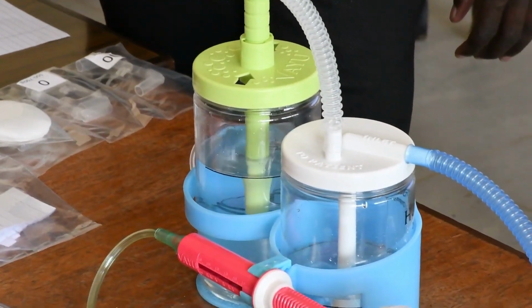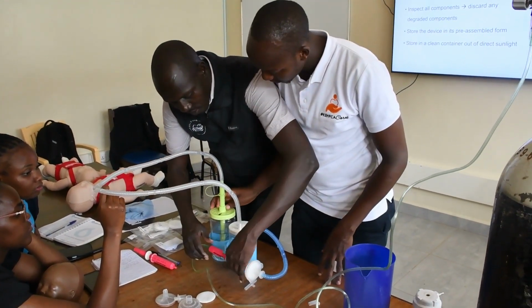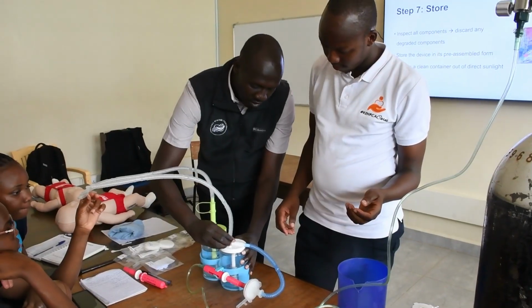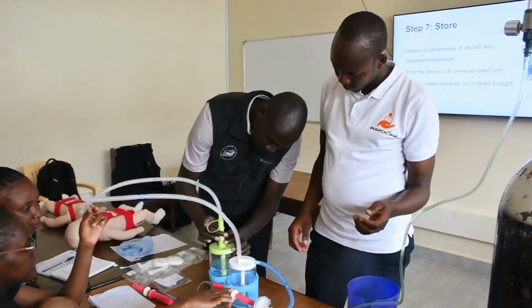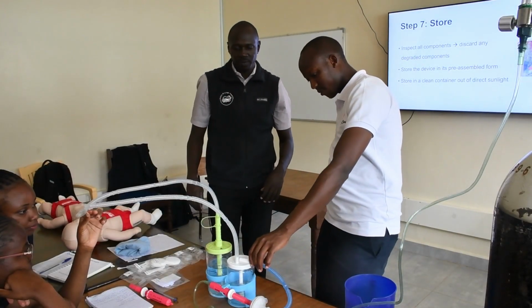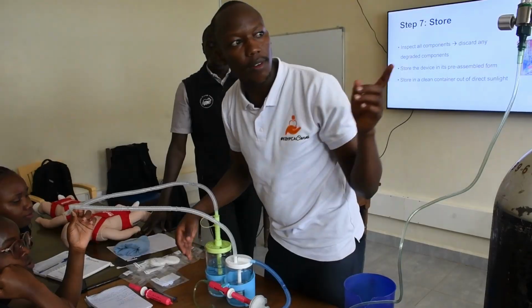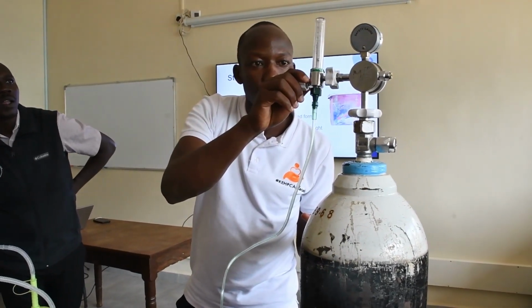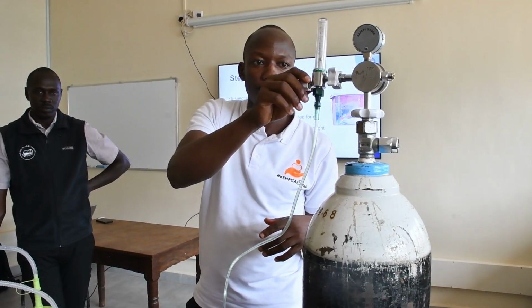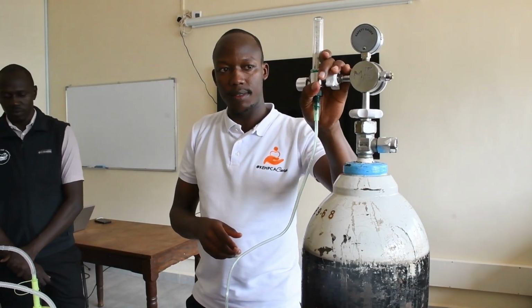The pressure here, we are at 6. Why is it not holding? We are at 4.